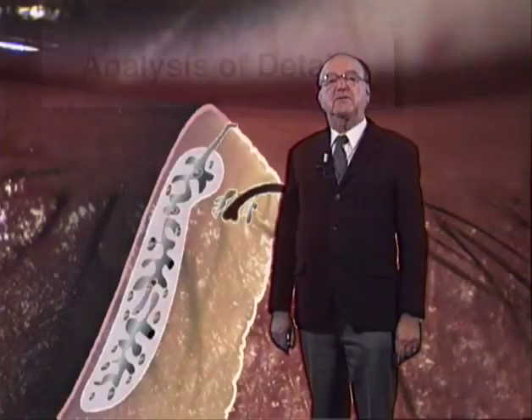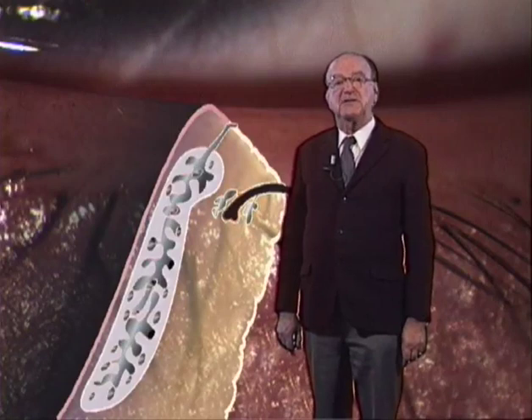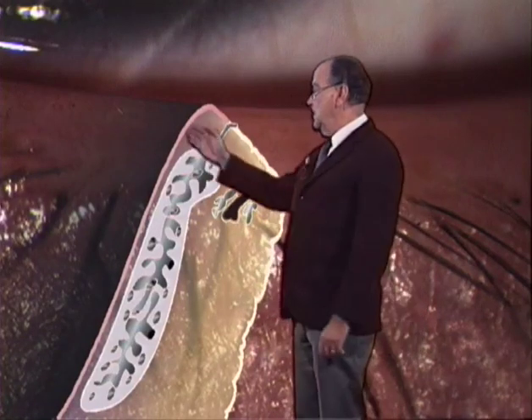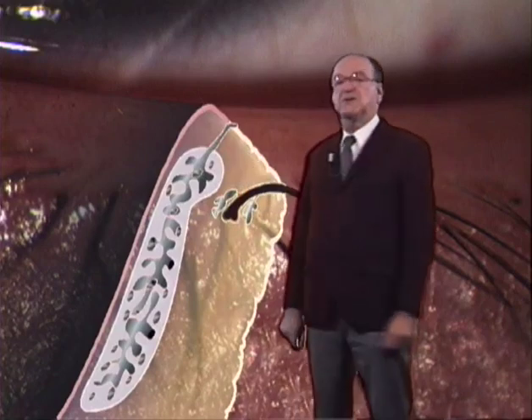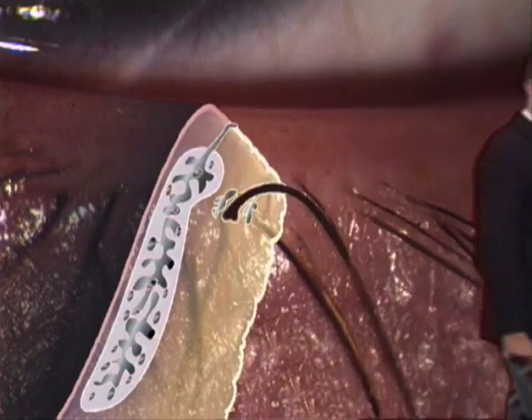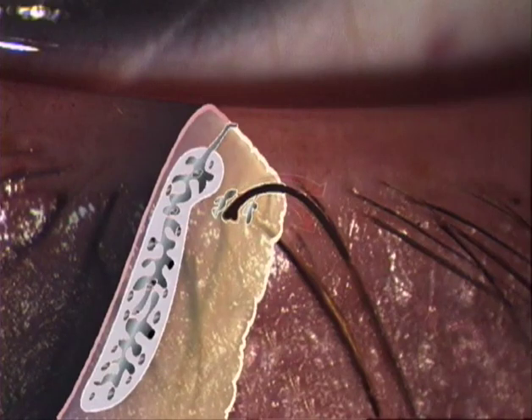Secretory and inflammatory materials around the lashes are signs of various diseases. The detection of their origin is essential for a proper therapeutical approach. The secretions may derive from either a local source at the ciliary roots, in which case they are signs of a disease of the ciliary glands proper, or the material may come from distant sources and just be trapped in the grid of the lashes.